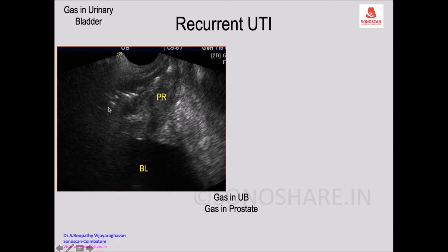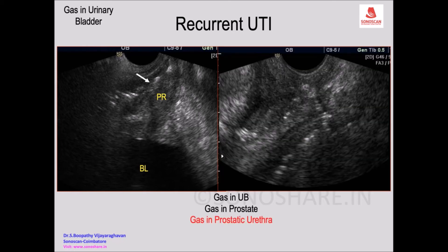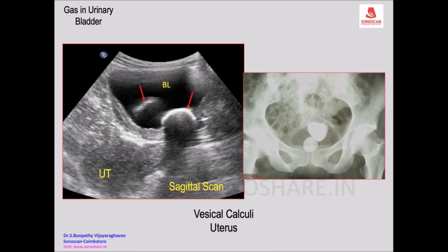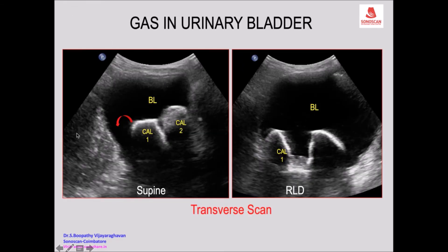When you draw the probe, you see the gas in the urinary bladder, and with dipping you see the column separating into two, confirming the intraluminal nature. You also see what appears to be an IUCD. With dipping, the IUCD falls to the dependent part whereas a calculus remains in place, indicating that the calculus is fixed to the wall of the urinary bladder.